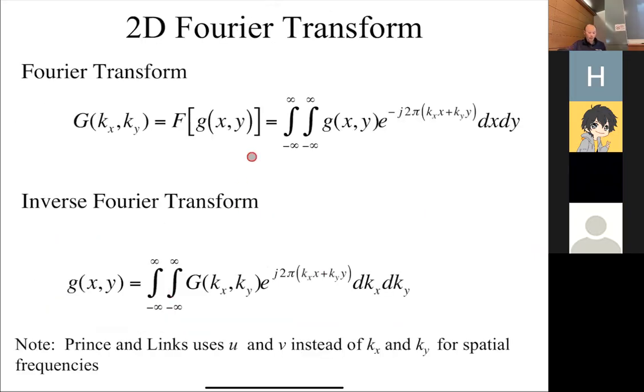So we'll start the discussion today. What we're headed towards is that we want to somehow implement this Fourier transform. We can see that with the gradients, we can implement this spatial pattern. The question is, can we implement this specific pattern of the phases? Obviously, the answer is yes, otherwise we wouldn't be talking about it, but that's the key: the gradients actually allow us to implement this. So we want to understand this a little more, and what we're going to do now is review a little bit about Fourier transforms.